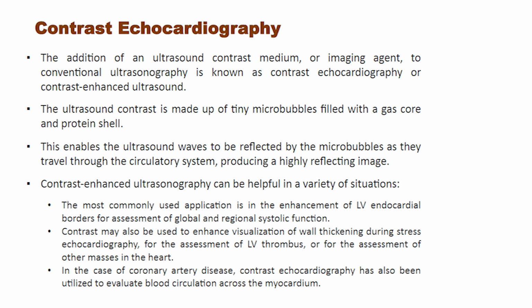Contrast echocardiography needs to be addressed in brief also. The addition of an ultrasound contrast medium or imaging agent to conventional ultrasonography is also known as contrast echocardiography or contrast enhanced ultrasound. The ultrasound contrast is made up of tiny microbubbles filled with a gas core and protein shell. This enables the ultrasound waves to be reflected by the microbubbles as they travel through the circulatory system, producing a highly reflecting image.